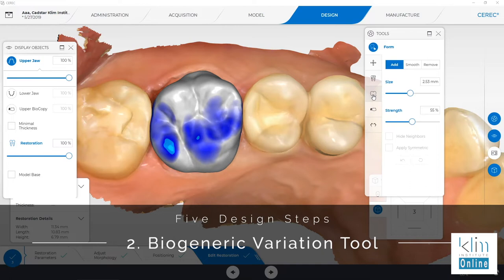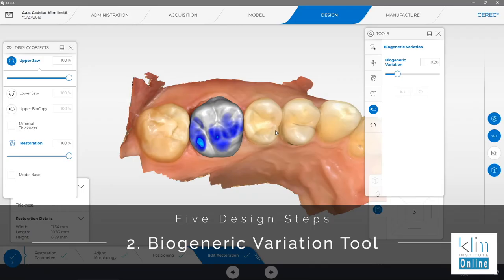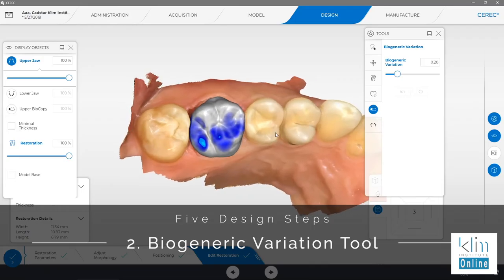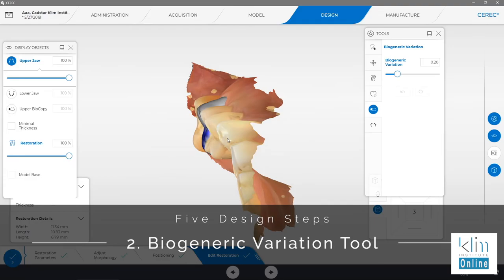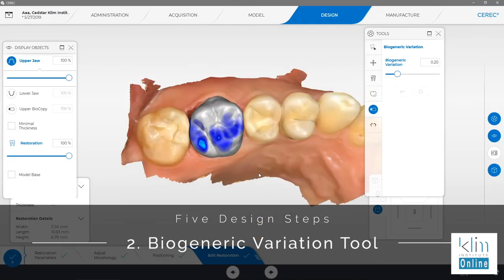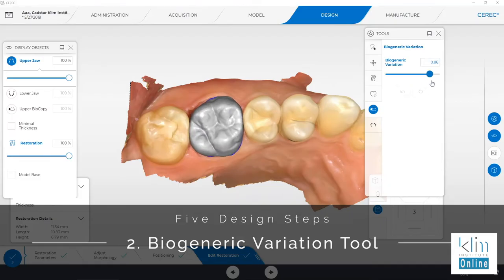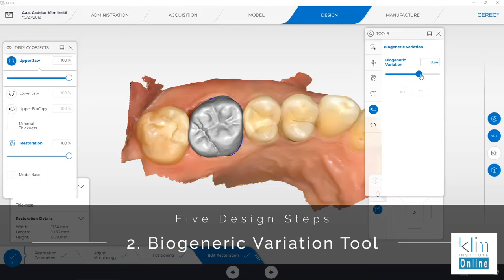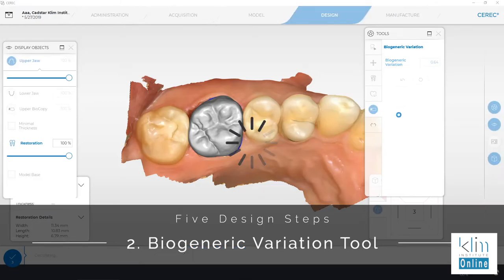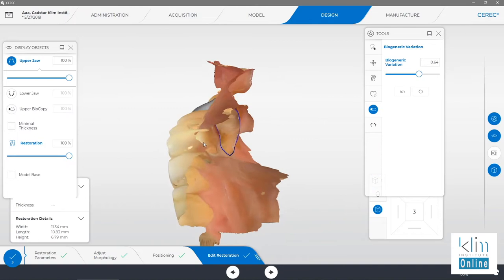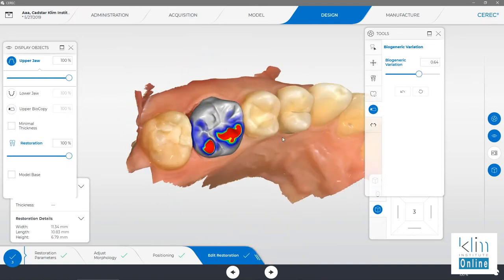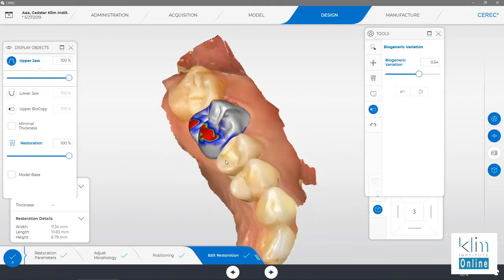Step number two is adapting the restoration with the biogeneric variation tool. This will provide many wax-up shapes morphologically at your beck and call. The buccal corridor looks pretty good at this time; the overall morphology for this case is pretty right on. Let's check what the biogeneric variation tool will do for us — scroll the bar and you'll see a lot of different types of proposals. Release where you see a proposal you like and the computer will re-propose. You can see there's a little different anatomy, and therefore this tooth appears to be strong in occlusion.